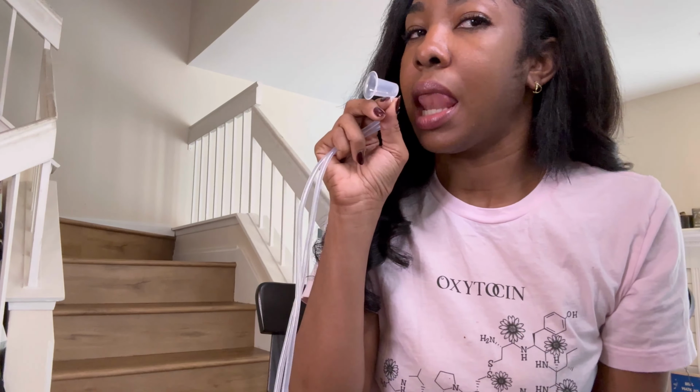So this is our small. This is a medium. This is a large. You want to be sure that you have the right size for your nipple to make sure that there is no pain or discomfort. If you have any skin allergies to this, or you develop them, or if you start to have uterine contractions, stop using it.